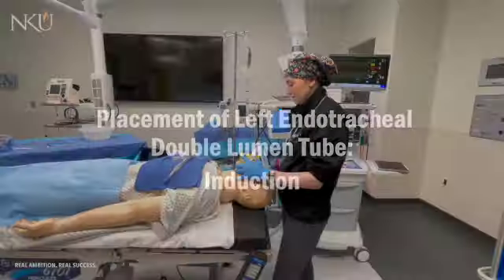I've just pushed rocuronium and it's been 2 minutes. Let's take a look. I'm going to obtain a view with my video laryngoscope. With the cords in view, I'm going to take my left double lumen endotracheal tube with the curvature anterior and place it. Once the bronchial balloon has passed the cords, I'm then going to remove the stylet. Now, with this motion, you're going to corkscrew the tube 90 degrees to the left. This motion is typically met with a lot of resistance.